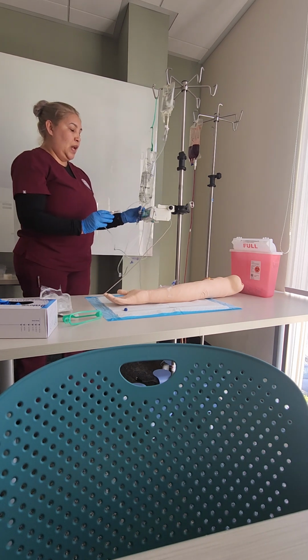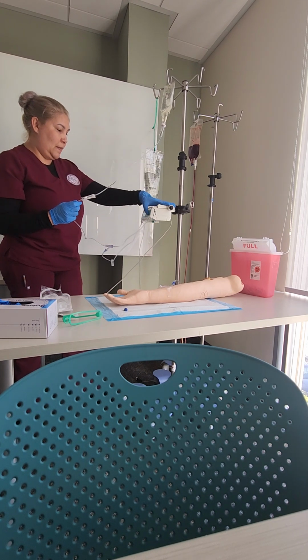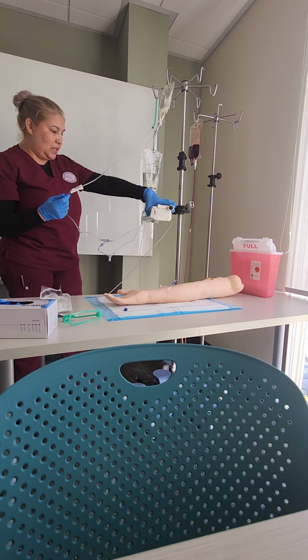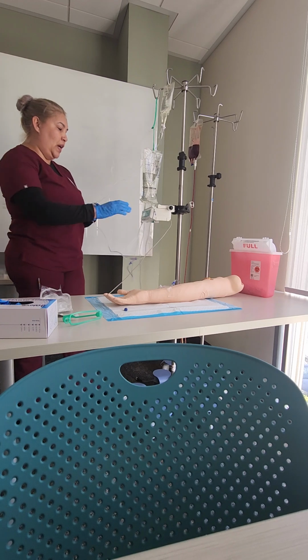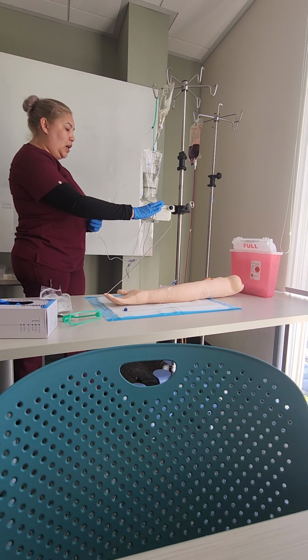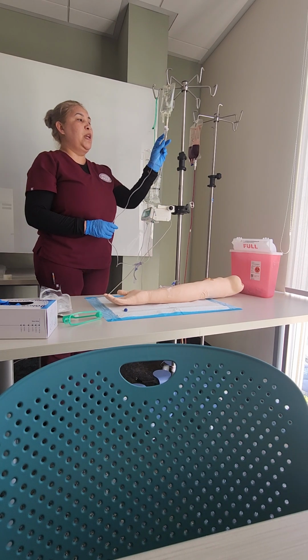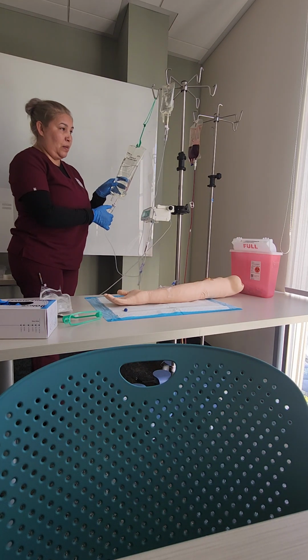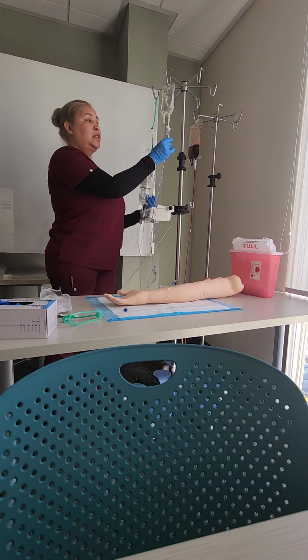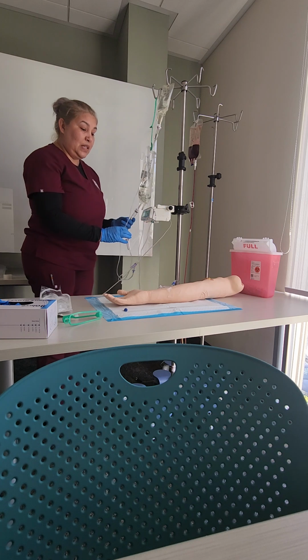What I want to do is start the process. So it's asking me, do I want to infuse now? I'm going to say yes. It's asking me to unclamp. Perfect. Let me go ahead and unclamp it and hit start. Okay. I want to make sure that it is dripping. I want to make sure that my primary is not dripping, that only my antibiotics are dripping, because that's what's going in first.